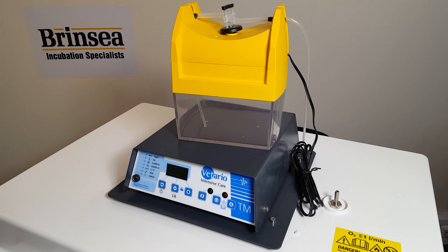With an optional humidity pump, the humidity can be finely controlled if required.